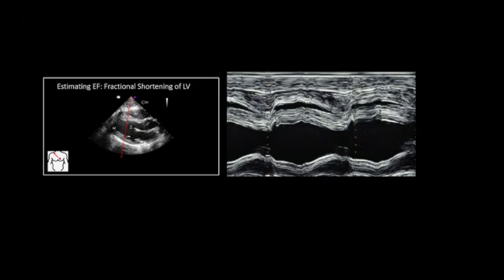So here's that tracing as it comes over time. Basically, what we see here is this line shows us the way the size changes in that left ventricle during the cardiac cycle. Here, where this cavity is quite big, this is the height of diastole. This is the largest amount of blood inside the ventricle as it's most relaxed. And here, with this other line, we have the point where the ventricle is the smallest distance across, where it's contracted the most. We see those same changes echoed up here in the size of the interventricular septum and in the posterior free wall.